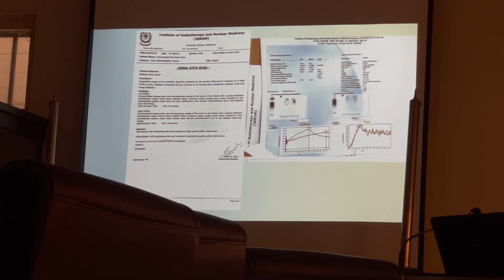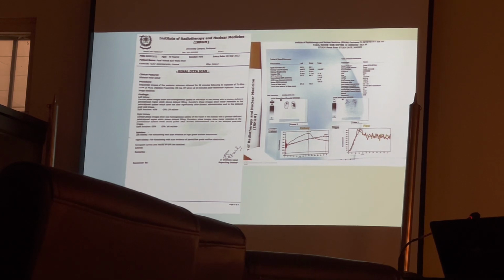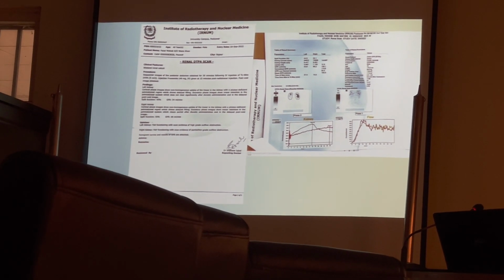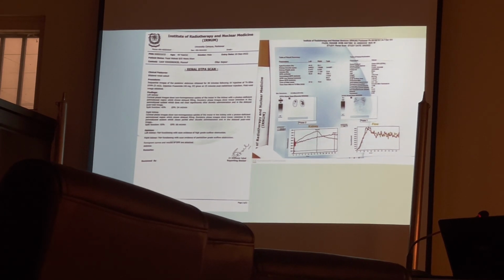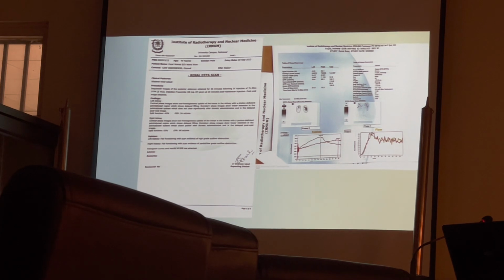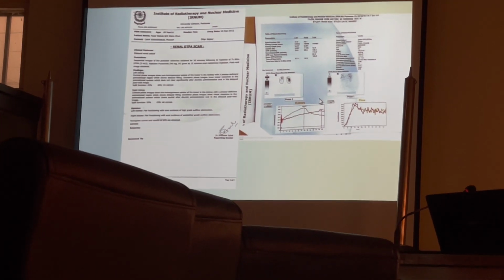The right kidney cortical phase images show non-homogeneous uptake of the tracer in the kidney with photon deficient pelvicalyceal system, which shows delayed filling. Excretory phase images show tracer retention in the pelvicalyceal system, which clears partially after the diuretic administration, and the delayed post-void images. This is the right kidney.